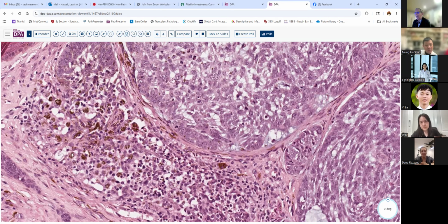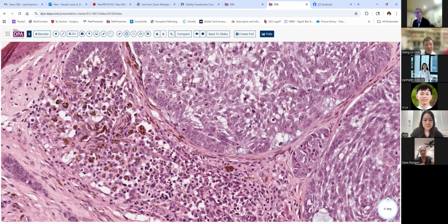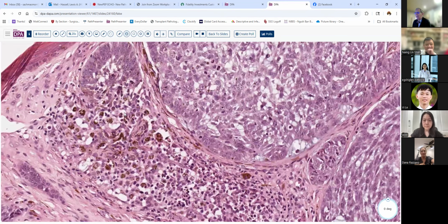Probably this area. Yeah, so what is it in that area that's different from what we've seen before? Looks more like dark and hyper... Yeah, there's dark stuff there, right? Yeah, okay. So who can help Yang out to know what that is?